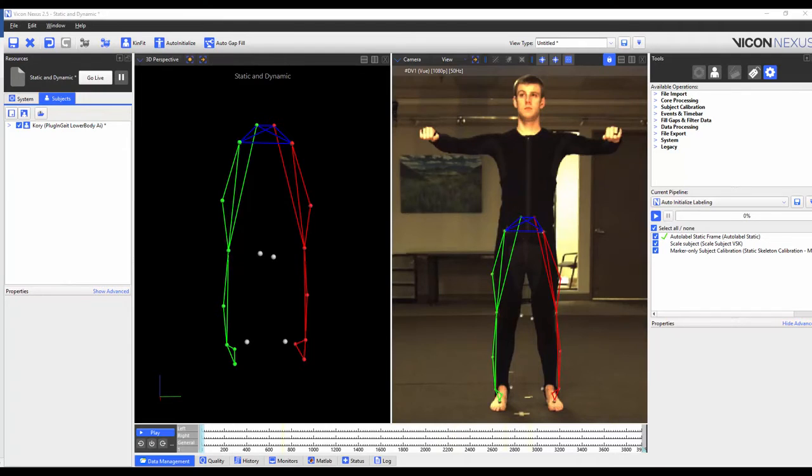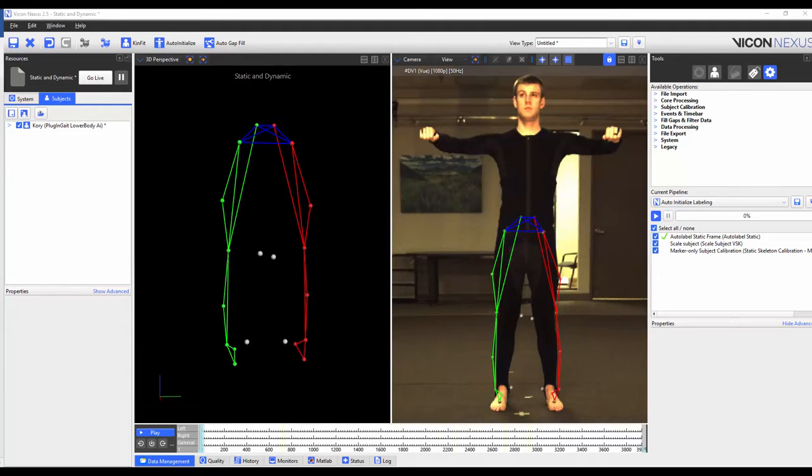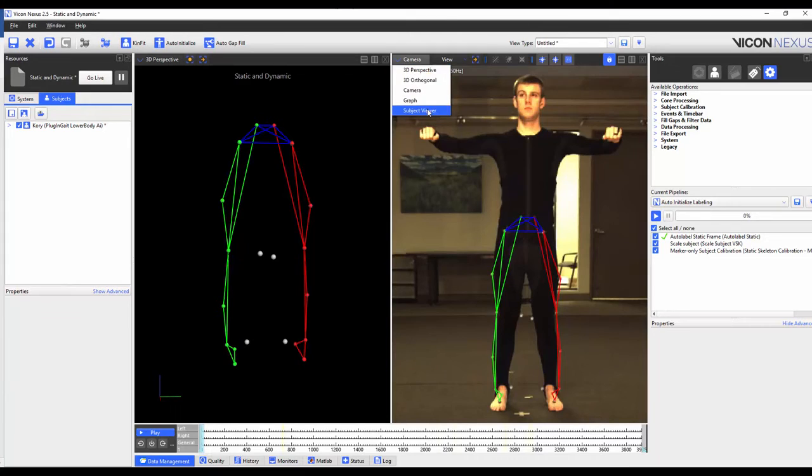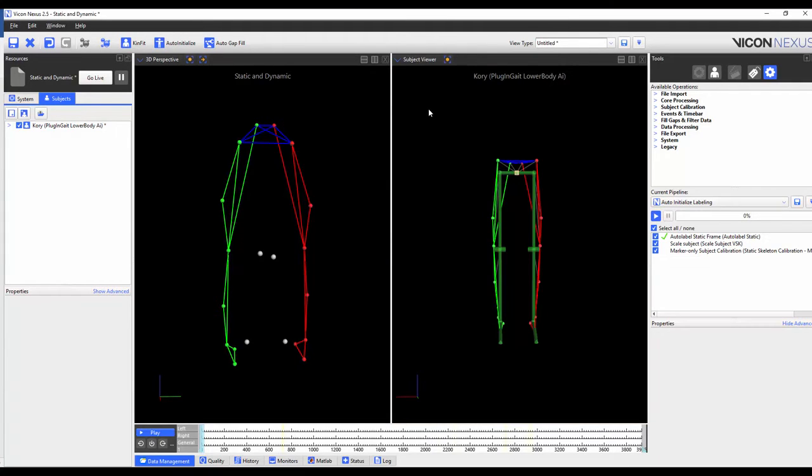Step two is to scale the subject VSK. This will scale the segments of the VSK to match the segment lengths of the subject. To illustrate this I'm going to load the subject viewer. When I run this operation you will notice that the model will resize accordingly to match the size of my subject.